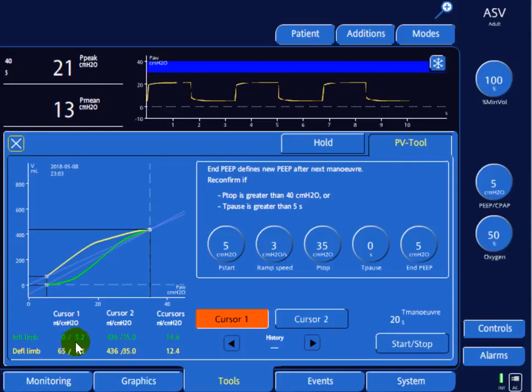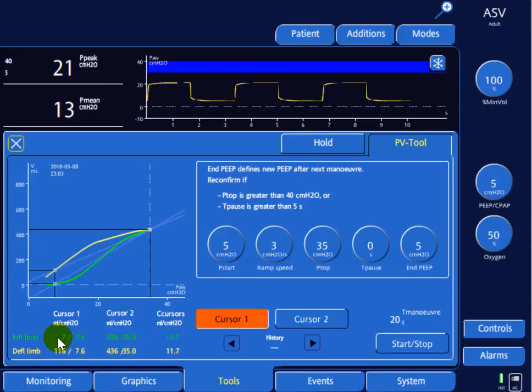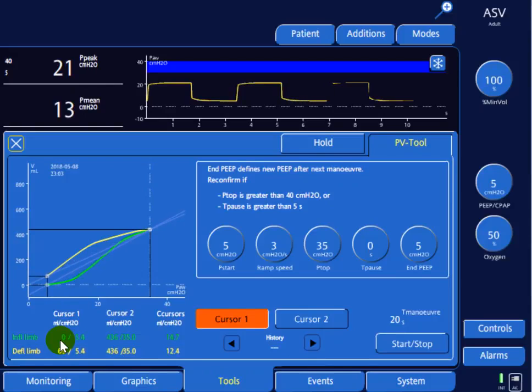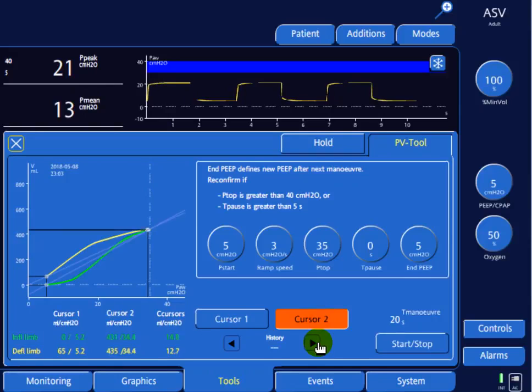At a pressure of 5.2, which is the PEEP, we see zero volume. As pressure increases, volume begins to rise — at a pressure of 10 we get 21 ml of air into the lung. We'll leave that cursor at this level and bring the second cursor down.